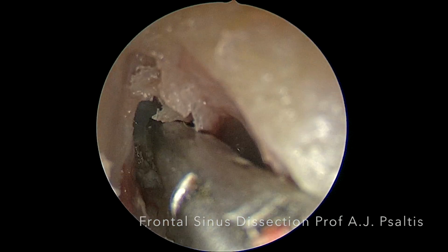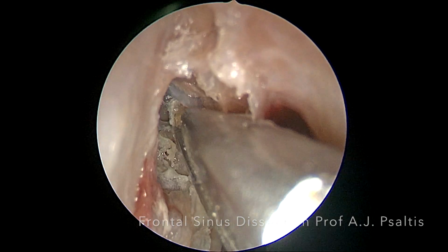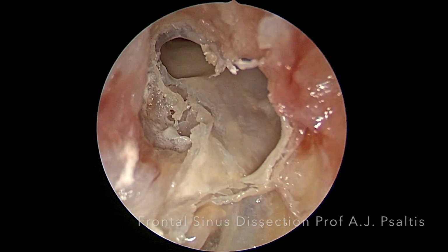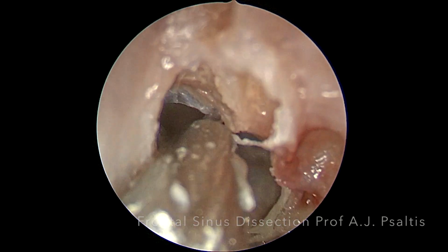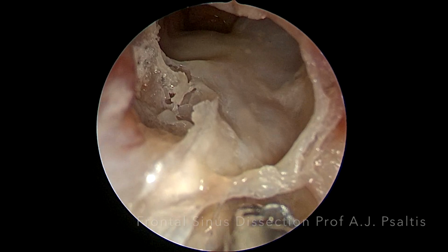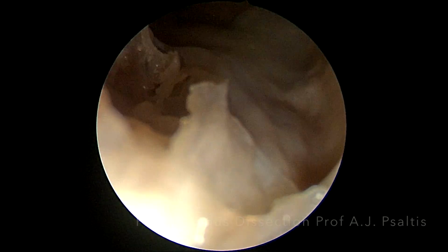Once this partition has been removed, we can use an angled Kerrison, also known as a cobra, to remove the remaining lateral portion of the intersinus septal cell. And here we can start to appreciate the frontal sinus proper. Ideally, I like to perform this dissection with scans to predict the anatomy, but where you don't have scans easily visible or you are concerned, staggered dissection is an alternative technique.